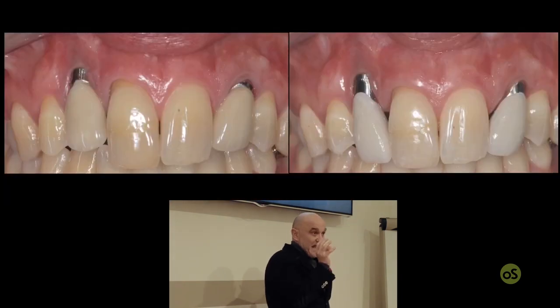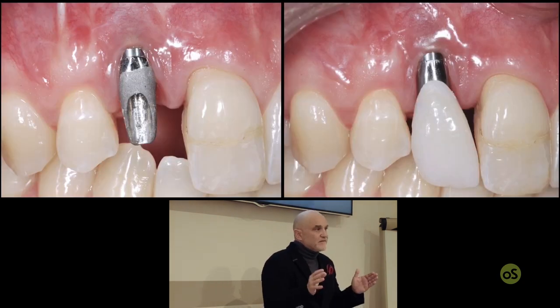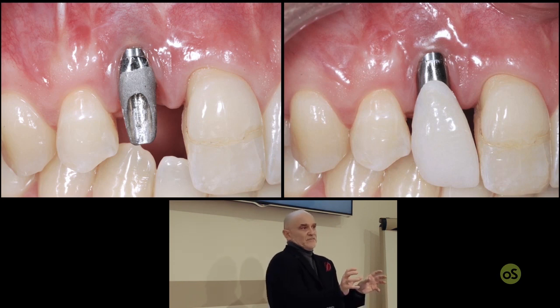So when the patient comes with gingival recession around the implants, the first thing to do is to tell the patient that the crown has to be removed, the abutment has to be changed in order to make it as narrow, as thin as possible, increase the space between the abutment and the two adjacent teeth, and leave the tissue fill this area.